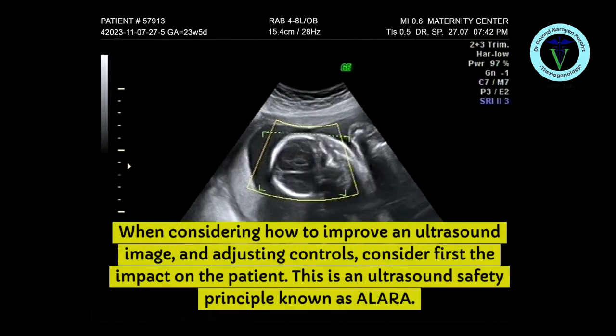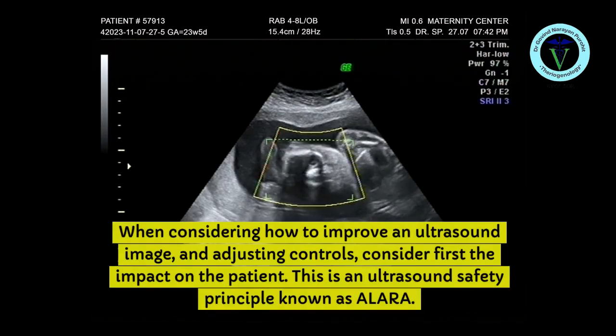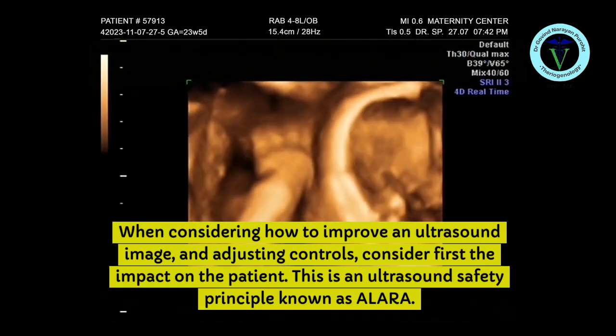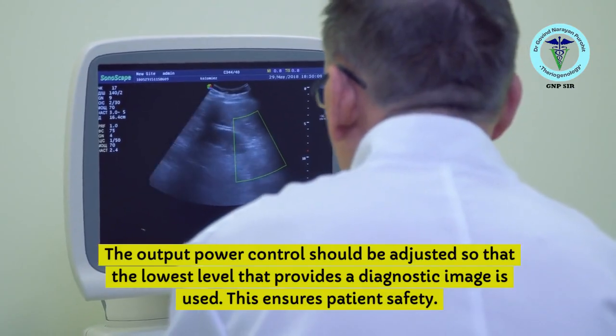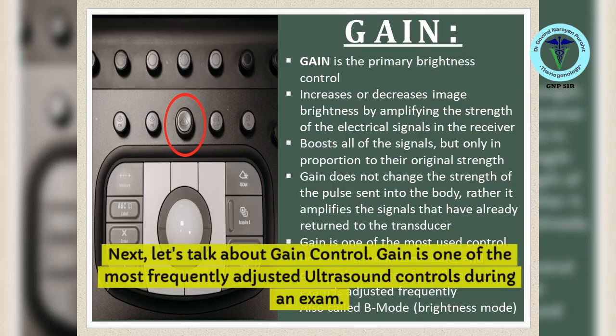When considering how to improve an ultrasound image, and adjusting controls, consider first the impact on the patient. This is an ultrasound safety principle known as ALARA. The output power control should be adjusted so that the lowest level that provides a diagnostic image is used. This ensures patient safety. Next, let's talk about gain control.